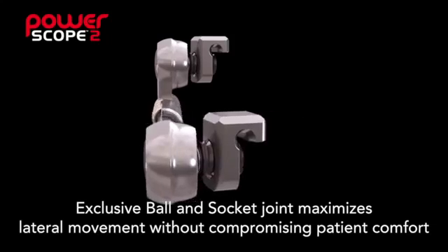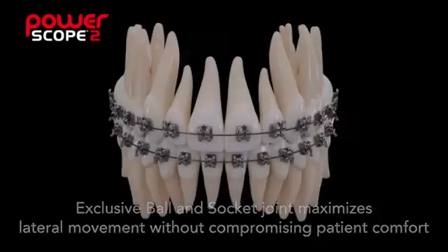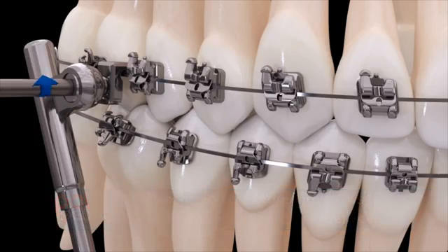This can mean reduced treatment time compared to other Class 2 appliances. The exclusive ball and socket joint helps maximize lateral movement without compromising patient comfort. Appliance delivery is safe and easy with PowerScope's hex head screw design, and the appliance uses a simple wire-to-wire installation.